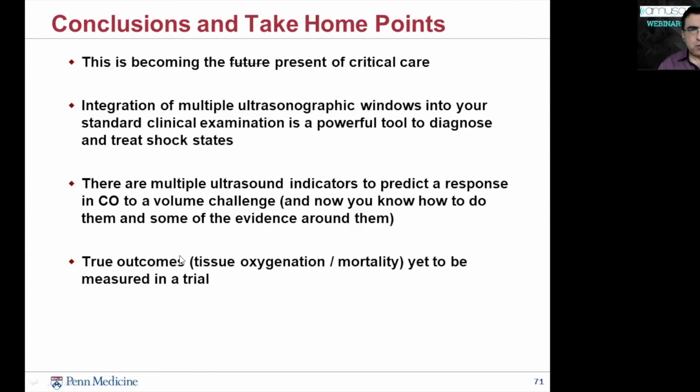Cameron, I don't know if you can understand this question. Dr. Luis is asking about the correlation. If we can find a correlation or direct relationship between cardiac output evaluated by the Fick method, I mean by gases and so on, and the echocardiography. Is there a correlation in between?